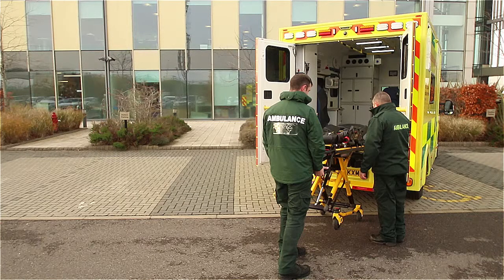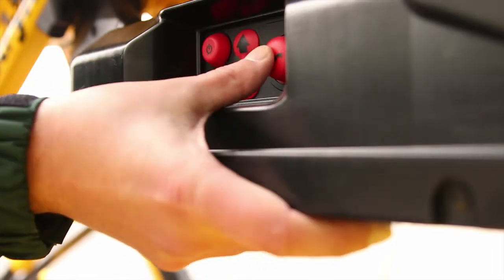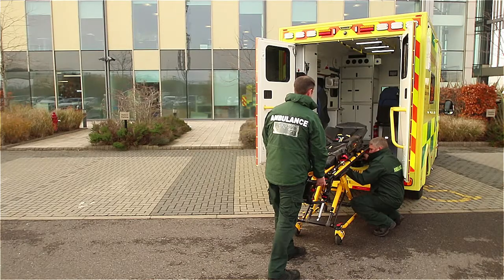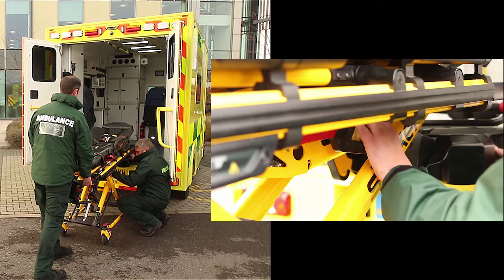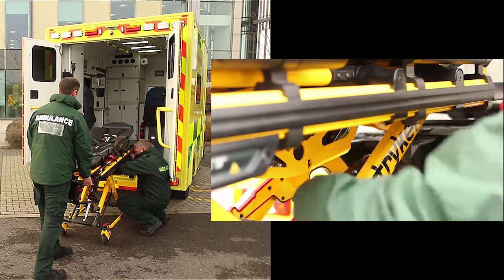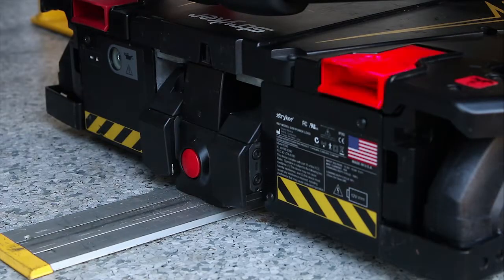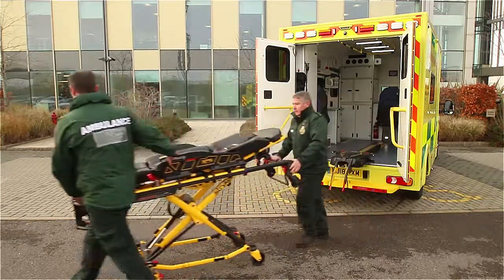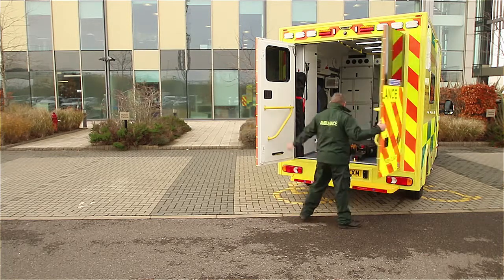One operator needs to support the stretcher at the front end while the other locates the control panel on the side of the PowerLoad system. Firmly press the lifting arms manual backup release button on the PowerLoad control panel to release pressure in the hydraulics. You can apply pressure to the lifting arms while pressing the manual backup release button to lower the lifting arms. Lift the red manual release handle on the PowerLoad to disengage the stretcher. You can then raise the lifting arms and guide the PowerLoad into the vehicle to close the ambulance doors.